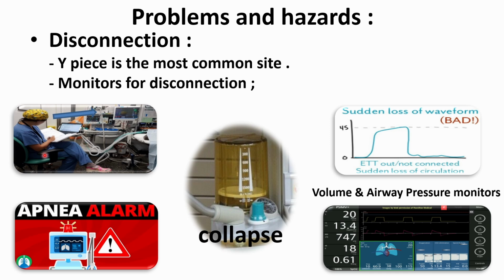You shouldn't leave the room during a working surgery, and you shouldn't use your mobile phone during the ongoing surgery. Your ear should be musical in order to detect a change in the tone of the pulse oximeter, and to hear the alarms as soon as they are announced.